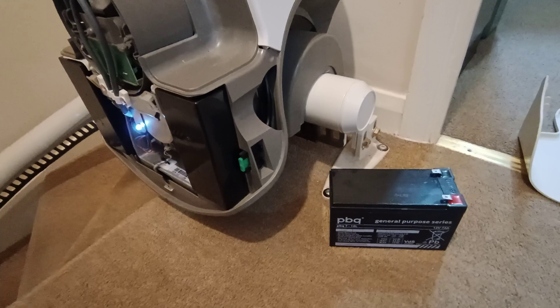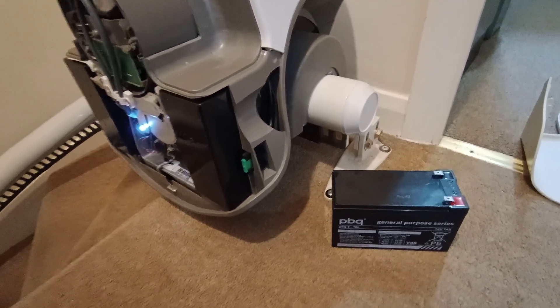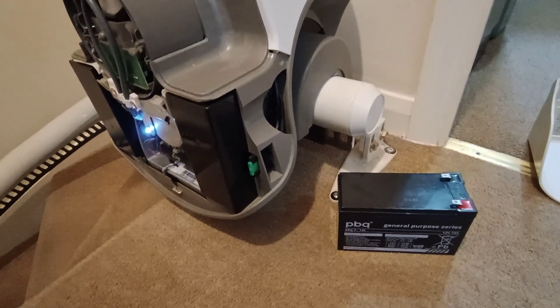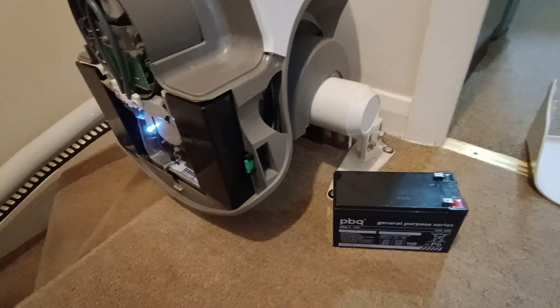I got it from our local electrical factor. I'm in a medium sized town in England and I was able to just pop up the road and buy it. I found it on their website, reserved it online, went straight up there, and half an hour later I was back home and able to fit it.